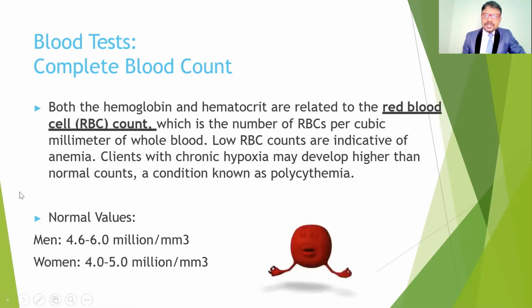And another blood test is the RBC count. So this one is the complete blood count, in which RBC is checked. What is the RBC? The red blood count, which is the number of RBCs per cubic millimeter of whole blood.